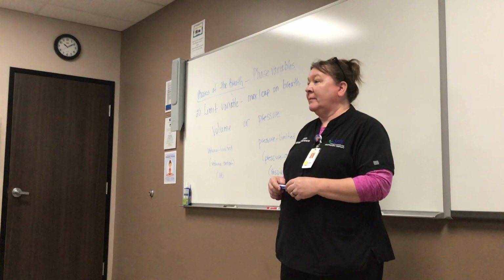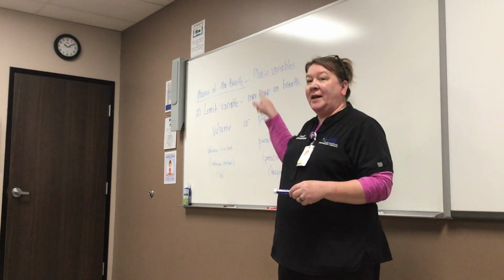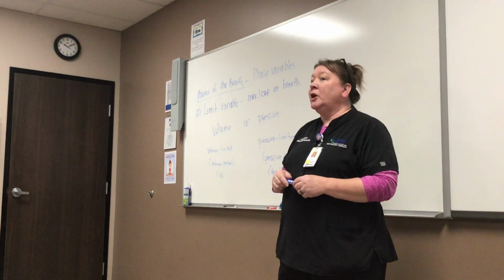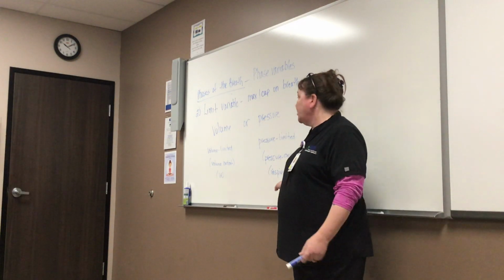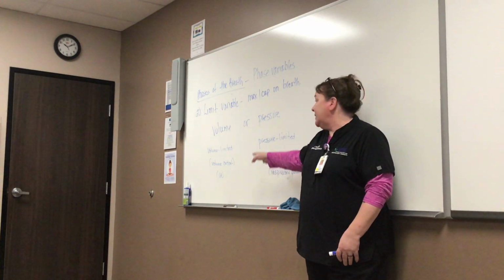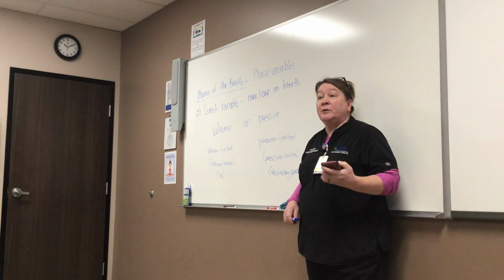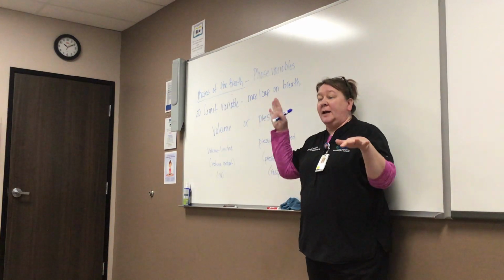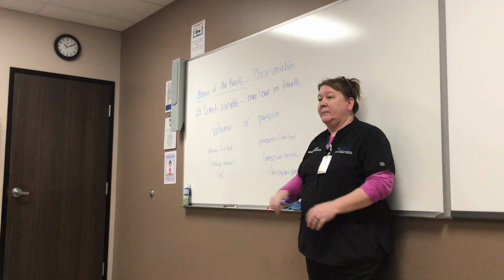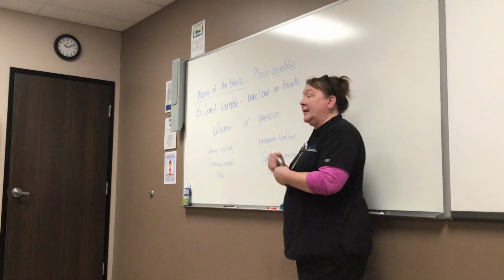Make sense? Is that after max? No, slash. Oh, slash. Max slash cap. It's like the top. So these are like your alarms that you're setting. No, alarms are different, because this is an actual setting as part of the breath. So I'm gonna set my tidal volume at 400, which means it's not gonna go above 400. My alarms are gonna be above and below that setting. So say, if you go this high or this low, then you need to alarm. So this is actual settings that we set. Okay? Easy peasy? I told you the last two were easier.